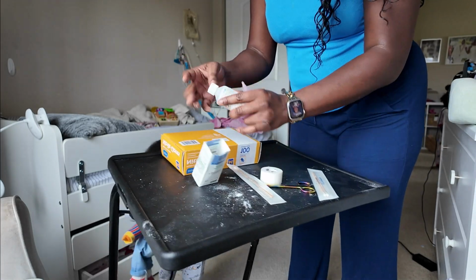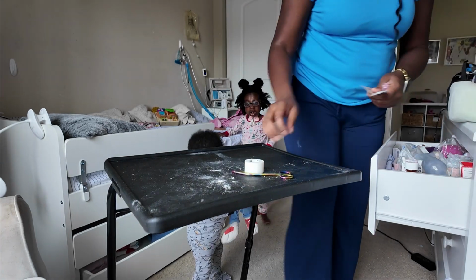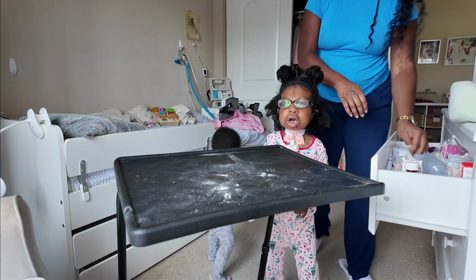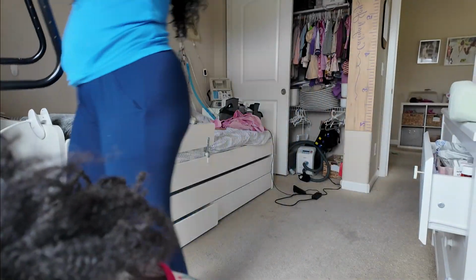Drop any questions you have below on trach care, how it works. Again, we do this every other day, sometimes every day, depending on how she's doing. And it is a big part of her routine. It's really important to make sure that area is clean so there's no infections, and it's our day. You know, we've become more confident as we've gone.